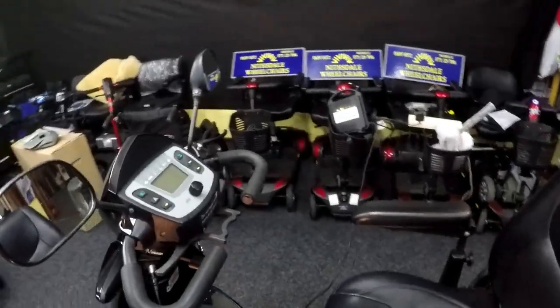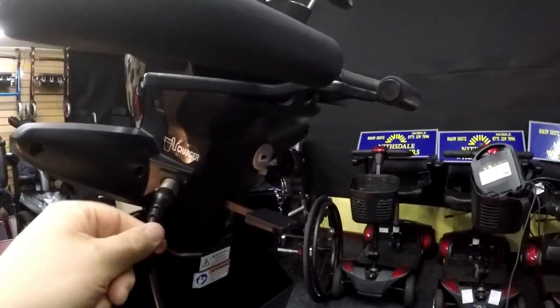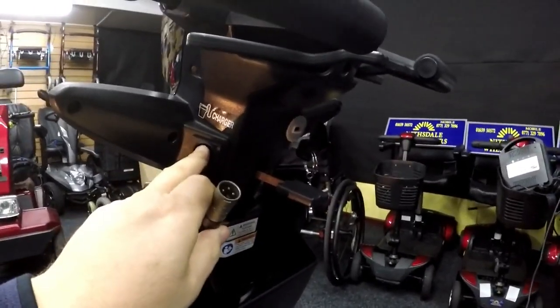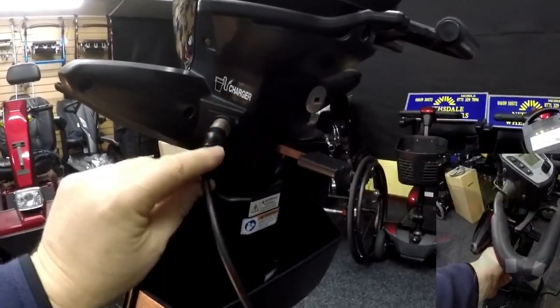Either the batteries are faulty, because it's not getting enough power, it's not seeing the batteries, or there could be a slack connection. The slack connection is usually this part here, because it's very fractionally bigger, and therefore it makes a slack connection. So sometimes it will charge and most of the times it won't.